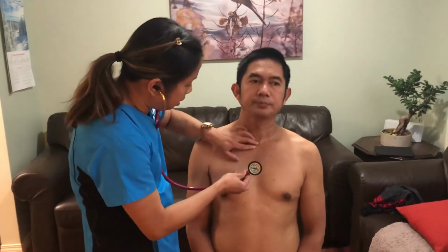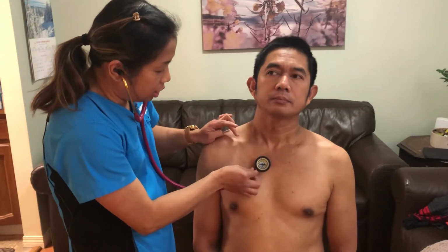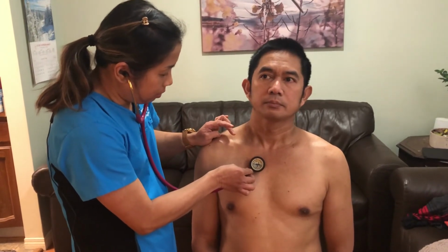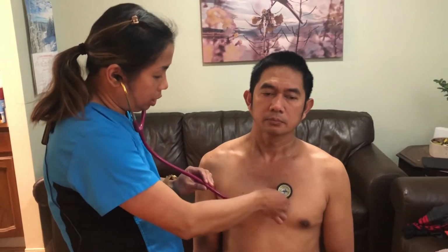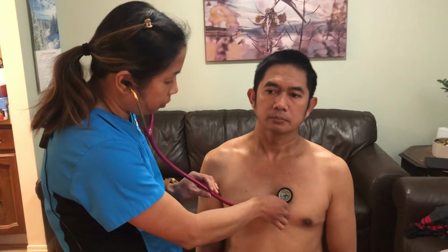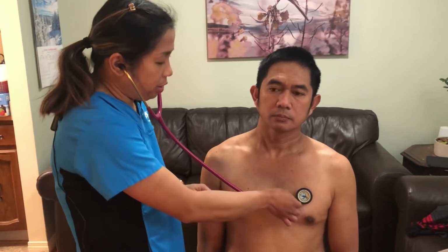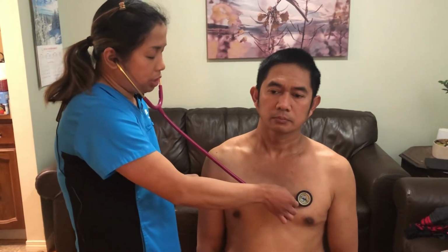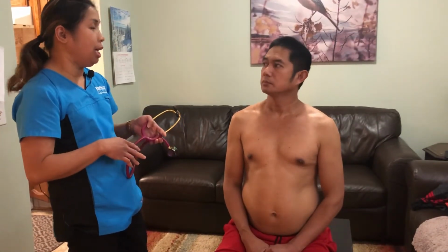Now I'm going to use the bell of the stethoscope to determine if there's any bruit or abnormality. From the sternal notch, going to the second intercostal space, which is aortic. It's here. Lub-dub. Then your pulmonic valve, going down to the tricuspid valve, and then to the mitral valve, which is the mid-clavicular line of your fifth intercostal space. Upon auscultation, your S1 and S2 sounds are normal. I didn't hear any abnormality, murmurs, or adventitious sounds.